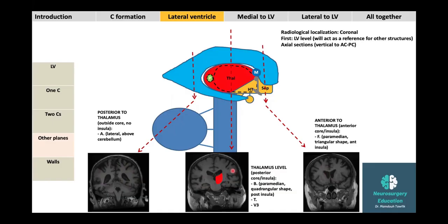So first thing, which part of the ventricle is this? Is this horn lateral or paramedian? Midline is here. So is it lateral or paramedian? Paramedian. And here, the body? Paramedian. This one, right here? No, it's lateral. Meaning here, it touches the midline. Both horns touch the midline. Here also, both horns touch in the midline. But this one, they are far from the midline.